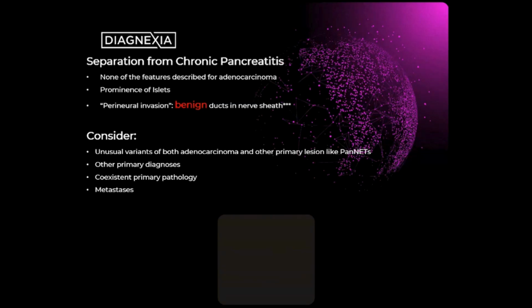And this is where experience counts. If you've never seen a chronic pancreatitis and you've never seen an adenocarcinoma, and this is your first case of a pancreas frozen section, and you're confronted with this dilemma, then call for help. Do not be forced into making a diagnosis. Once you have established it's either chronic pancreatitis or adenocarcinoma, you build on that experience. You learn from the case.